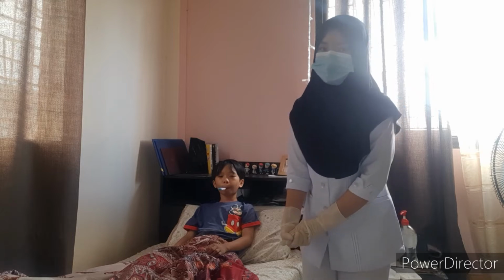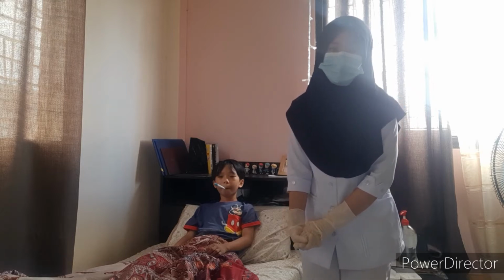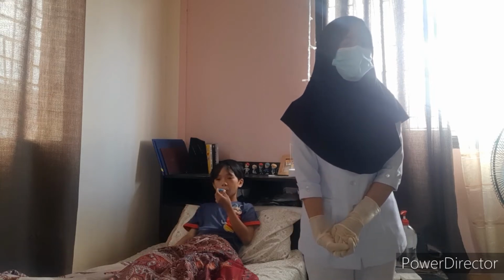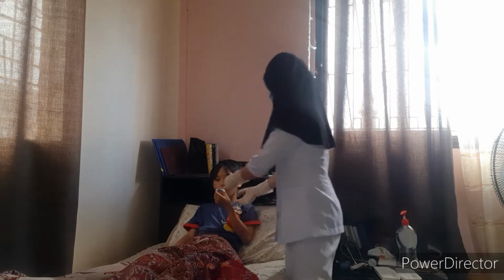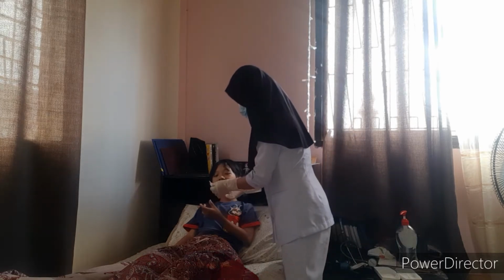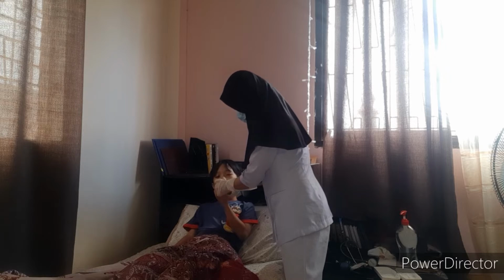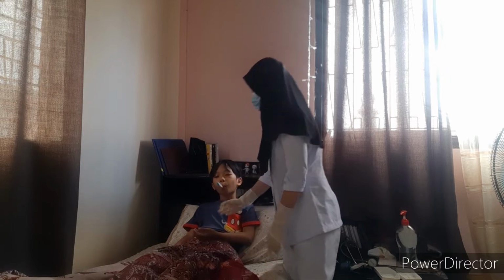So instruct the client to close the lips around the thermometer and to keep the mouth closed around the thermometer until it beeps and gives a reading. It may take a few minutes, so tell the client to breathe through the nose while waiting. So this is to provide sufficient or adequate time for recording the temperature. And breathe in your nose.